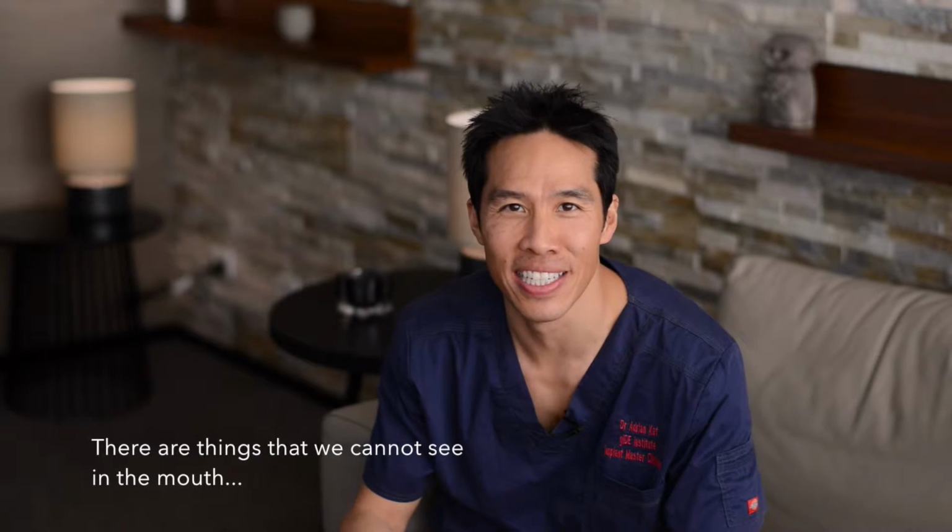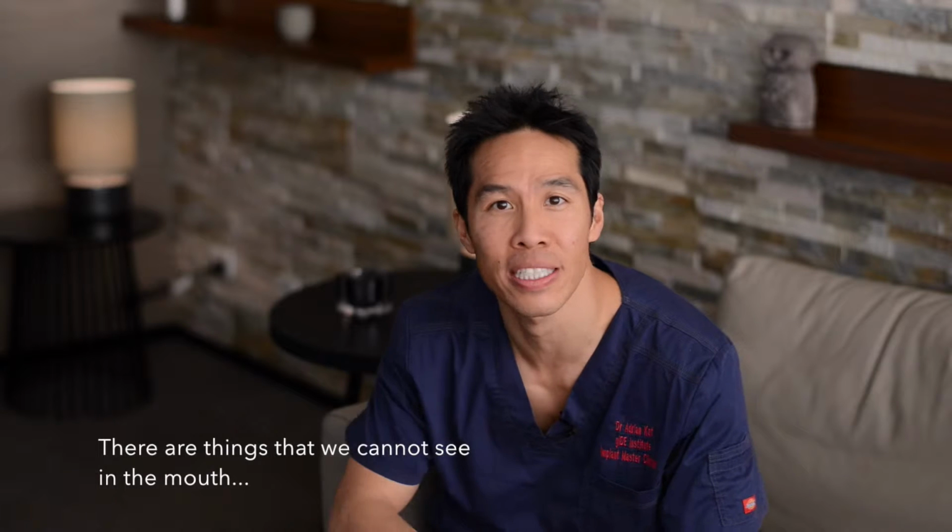So what is a bone scan and why do we need it? In dentistry, there's a lot of things that we can't see. We can't see under fillings, we can't see under crowns, we can't see bone levels because it's covered by gum. We also can't see in between teeth.